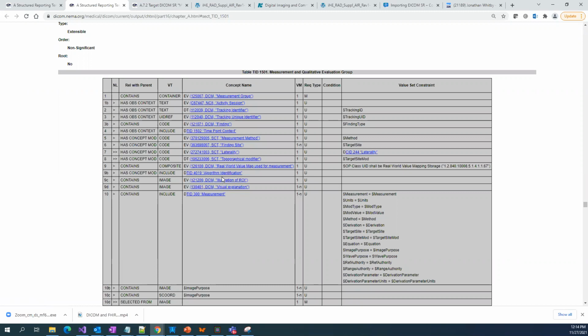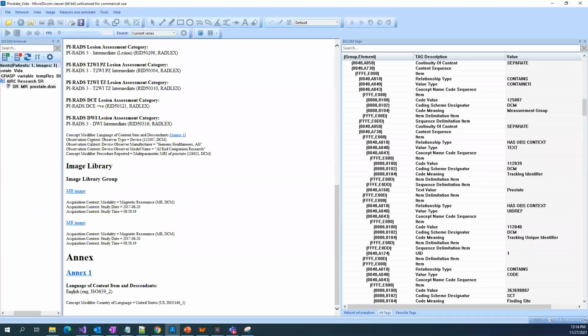When you start writing the DICOM files, you will have to go through each of these things and start writing the exact way what is expected out of this specification. Let's go through one DICOM SR, which I have got from one of our systems, which has generated some AI result related to prostate cancer. I showed this yesterday. Arun also was trying to show you this.